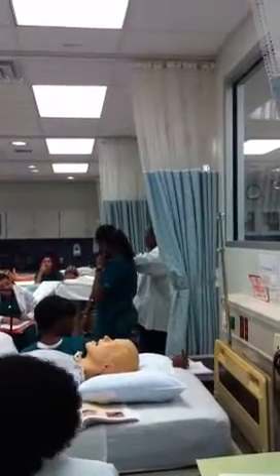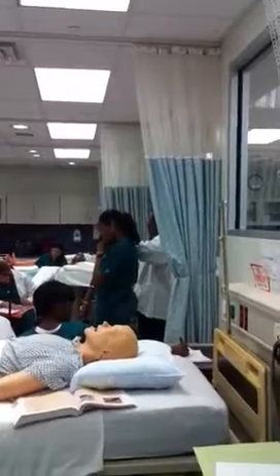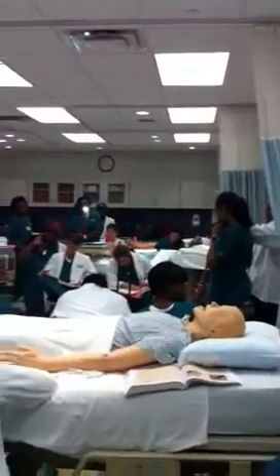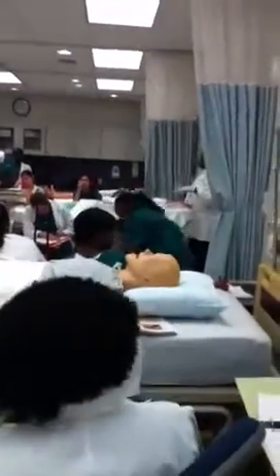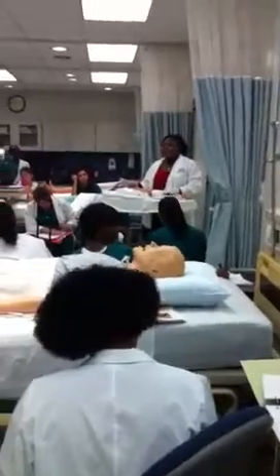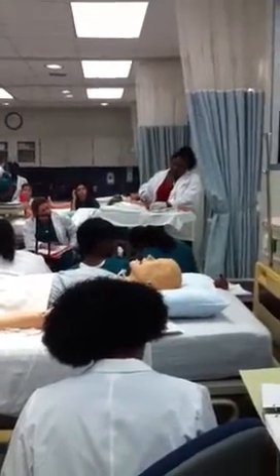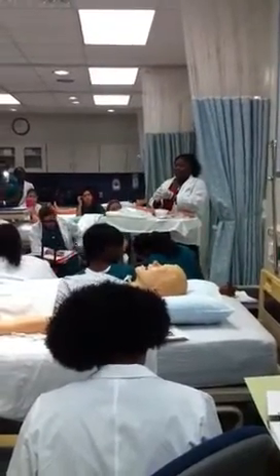You see that? And while I put that needle in, it's going to remain stretched. When I push the fluid medication in, it's going to remain stretched. When I'm done, then that's it. All right, we got that? That's a critical element, guys. Pinch skin, sub-Q; stretch skin, IM. Yes, ma'am. Thank you.